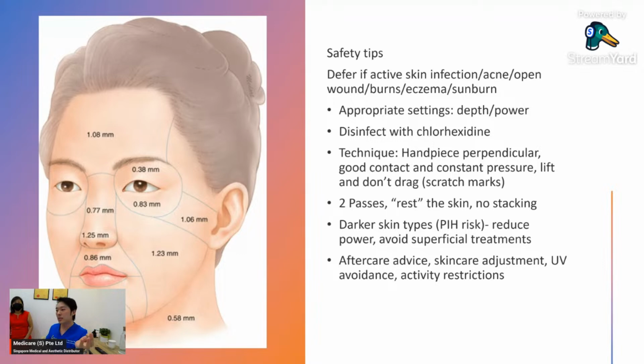And number two, which we see with all microneedling devices, is that you shouldn't drag it along the skin. Especially when you get more used to it, you try to go at higher firing rates, and the impulse is to drag it along the skin so that you can speed up the treatment. But if your needles haven't fully retracted and you're dragging it along the skin, you could scratch the patient, and then you get scratch marks that take a week or so to heal. So that's another pitfall.